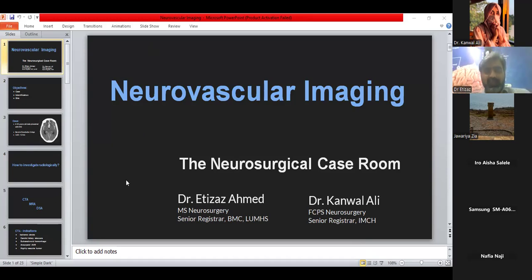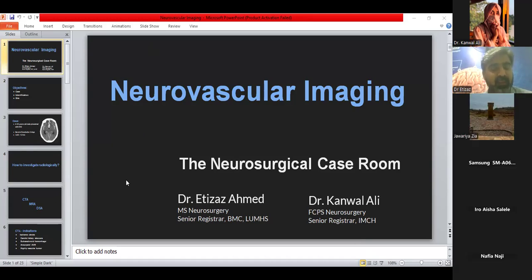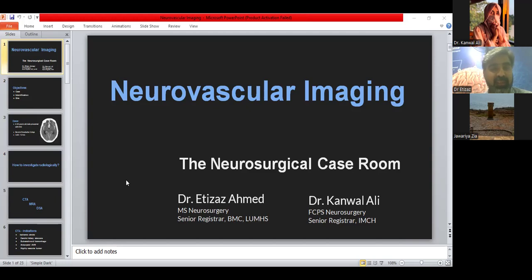So, this is the second session after radiology, and we thought that before going to discuss the vascular problems, it is very important to go through the basic anatomy and angiography of the neurovascular system, especially the brain. So this is the start.